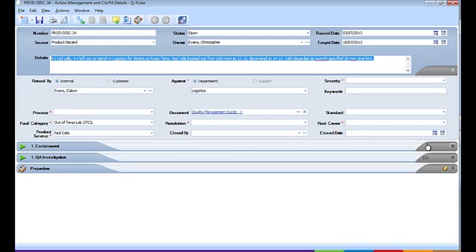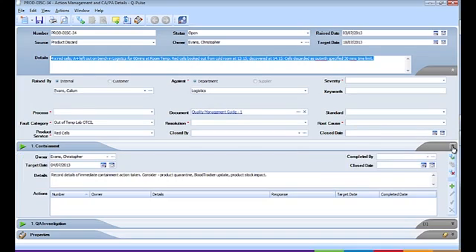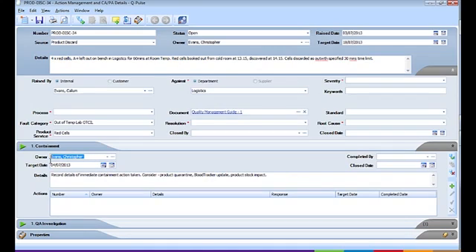So let's move through to the stages, the first stage being containment. We have default again for staff member within the QA team. We have a default target date. We have default action that must be reviewed and acted upon. So here the QA team member is recording that the blood tracker system used to record stock levels has been updated and confirms product discarded.